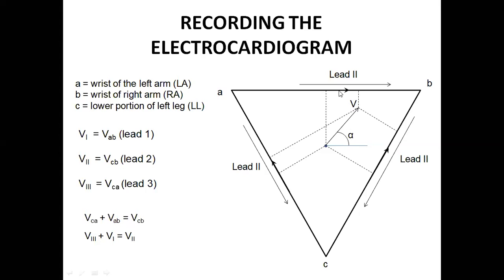Because this lead 2 and this line are parallel. Okay, we can apparently say that, not technically, it is apparently said, for assumption it was taken, because as the heart is there, we can clearly take a parallel of lead 2 and take an angle of alpha.